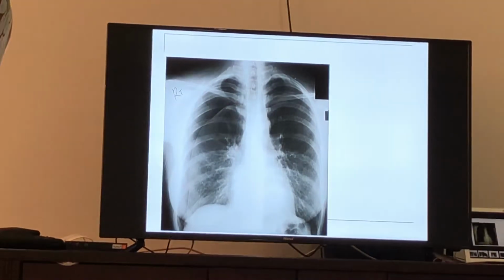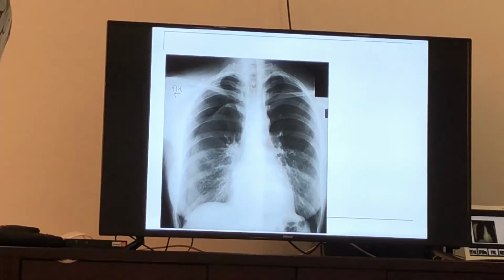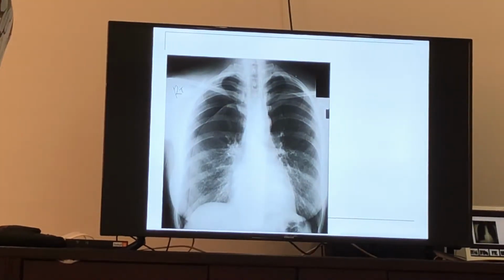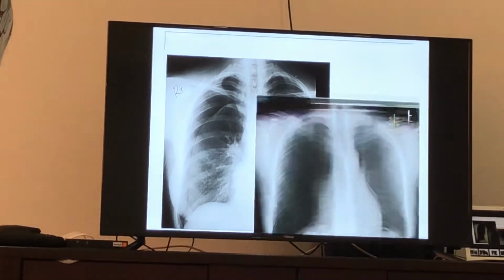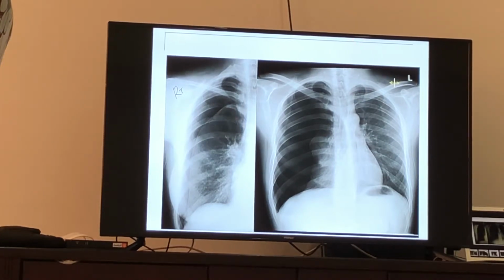Of course, if the patient is symptomatic, this is more than 2 centimeters. If the patient is stable with more than 2 centimeters, usually you just drain, you aspirate. On the spot, you can aspirate, remove, re-x-ray him, he's fine, he can go home. Okay, if he's symptomatic, then he should be admitted and we should put a drain and drain it under water seal. This one, same? Same. But more extensive than the one before.